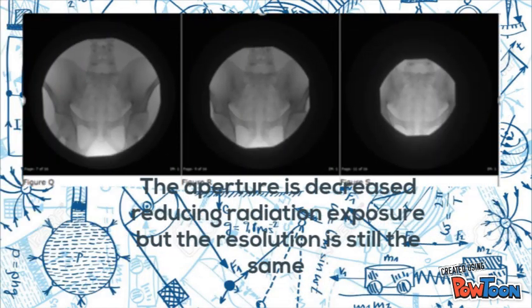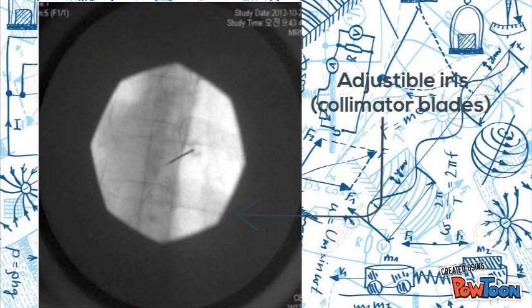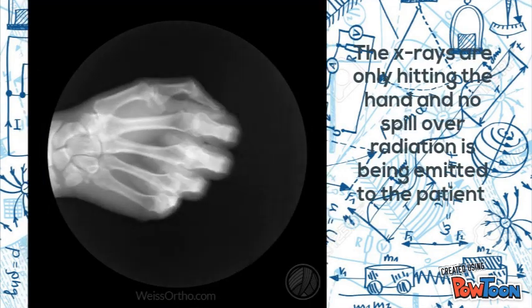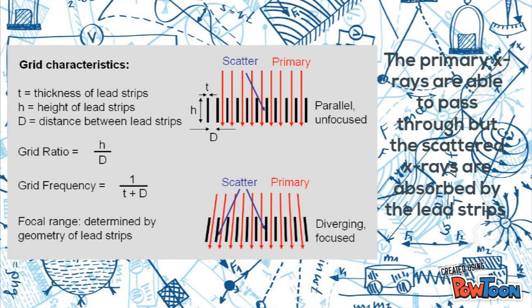The collimator is a circular or rectangular device which matches the shape of the image receptor that limits the patient's exposure to the X-ray field. If the doctor wants to limit the field of view to reduce radiation exposure, the collimator blades will move and adjust the field of view to reduce spillover radiation. The job of the collimator is to minimize radiation exposure by reducing the field of view but still keeping a high resolution. As the body can scatter X-rays, the anti-scatter grid captures the scattered radiation emitted from the X-ray tube before it reaches the image receptor and refocuses the beam to increase contrast and resolution.